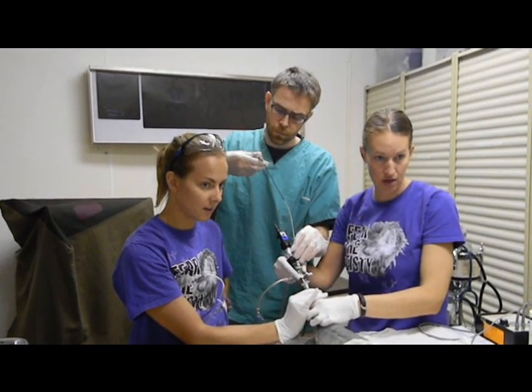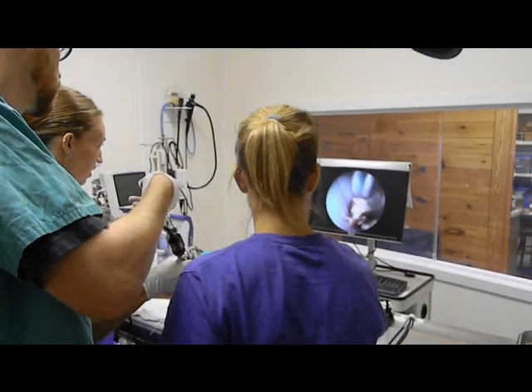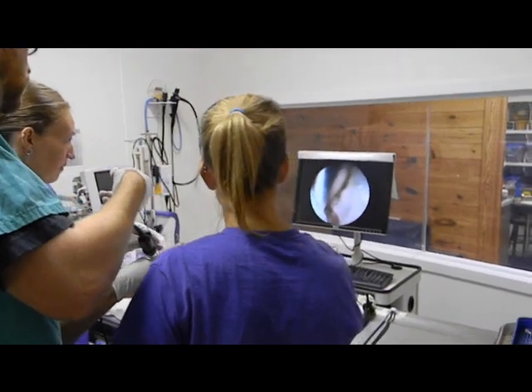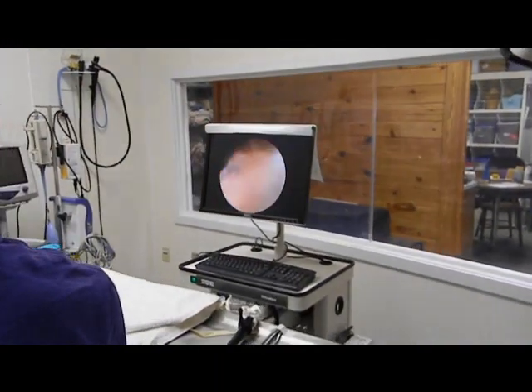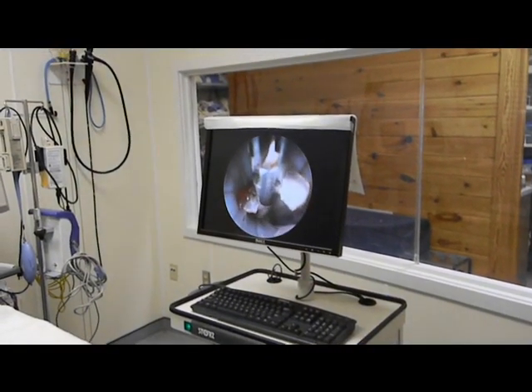Let me try and get our individual part. Let me see. Okay, open. Grab. Oh, awesome. Okay, almost. Come back in. Okay, open up.